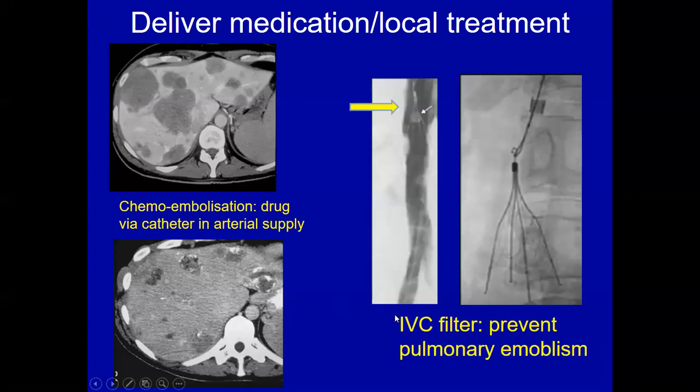This is a patient with IVC filter placement. Usually we do this to prevent clots from going to the lungs. So patients, for example, who had major trauma, car accident, he's got a DVT, and we cannot give the patient anticoagulation. So we want to prevent the clots from going to the lung. So we go either from the neck or from the groin, and then we do a venogram. This is the right, this is the left common iliac vein, this is the IVC, and this is a filter placed inside the IVC. We can remove it later if we need to.